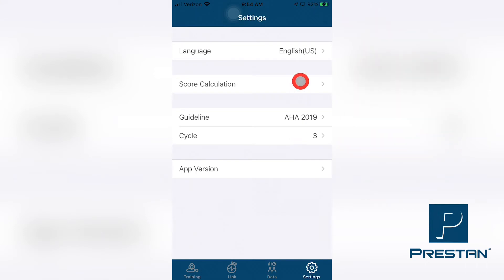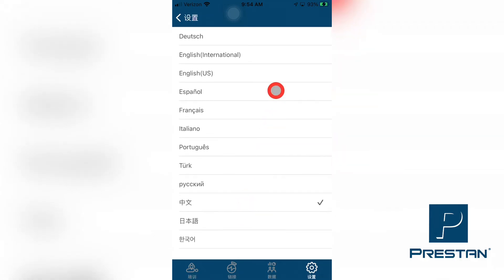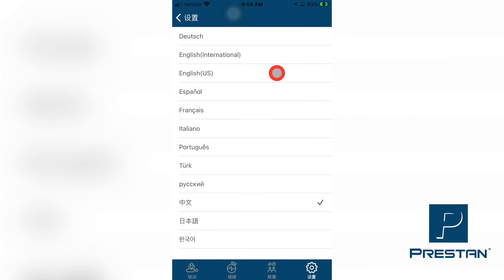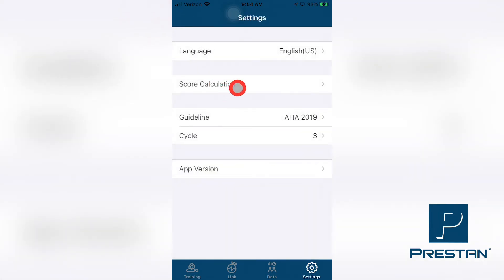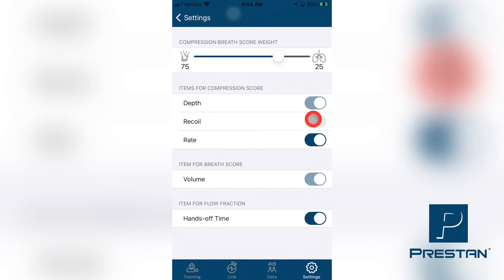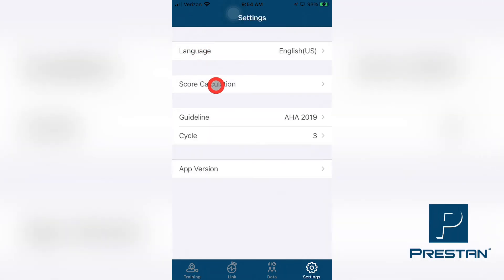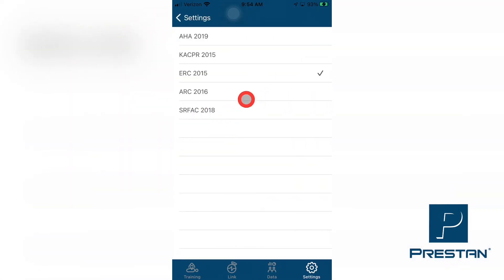The settings tab allows for the managing and changing of the settings on the Preston CPR Feedback App. These settings include changing the language and the measurement units used for the specific region in which the training is being performed, managing how the overall scores are to be calculated, and changing the CPR guidelines between the available options.